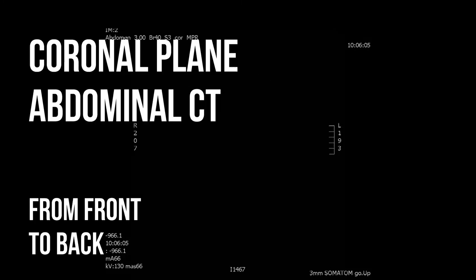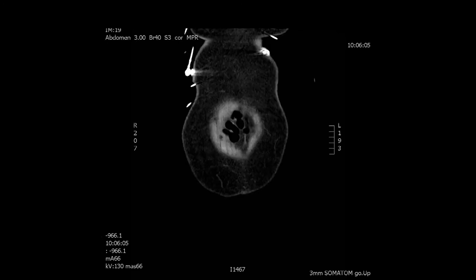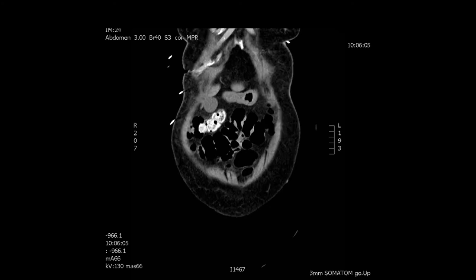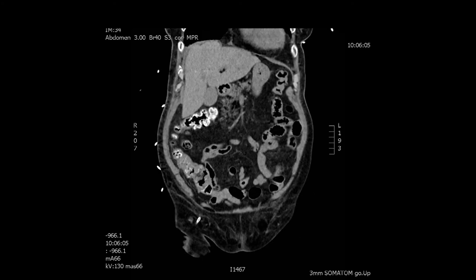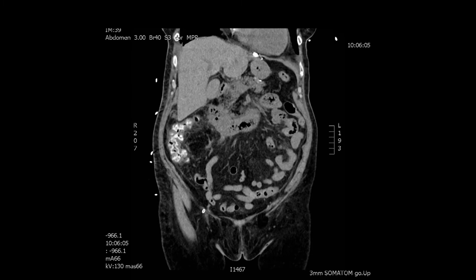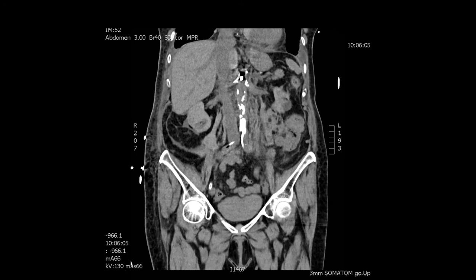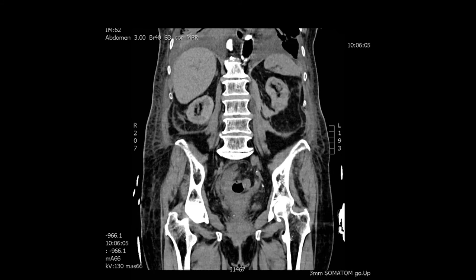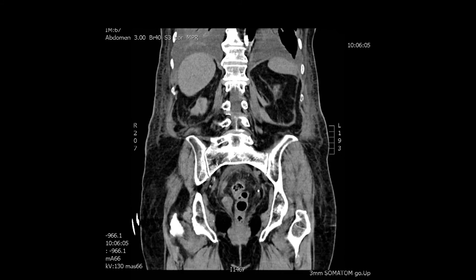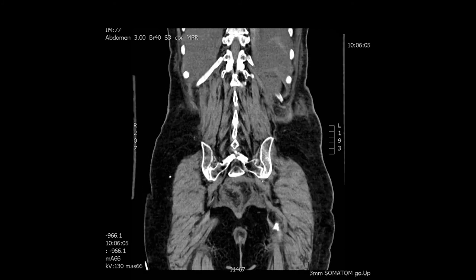Next we'll see the coronal plane of the abdominal CT from front to back to the abdominal wall. We can see the gut filled with air, liver and stomach, colon visualization, all the mesenterium, then the cava and then the calcified aorta and the spine. We then clearly see the pelvis and the femur, all the way to the back of the patient.